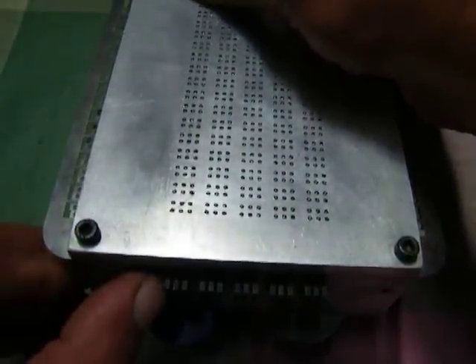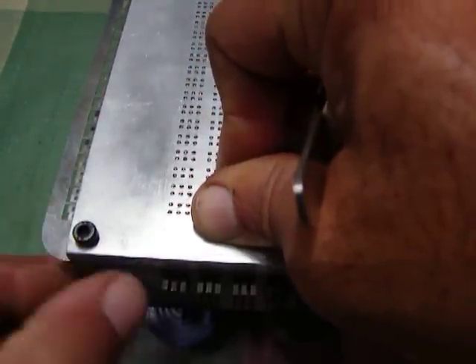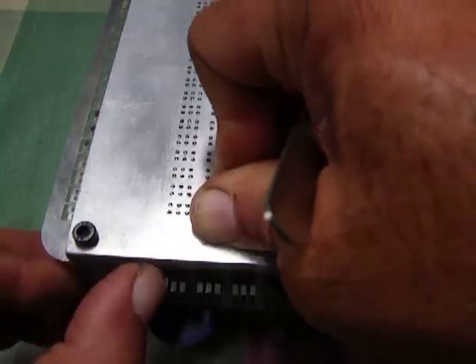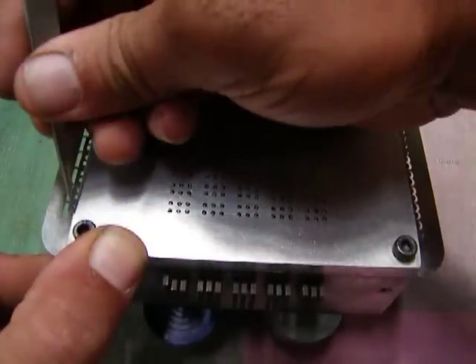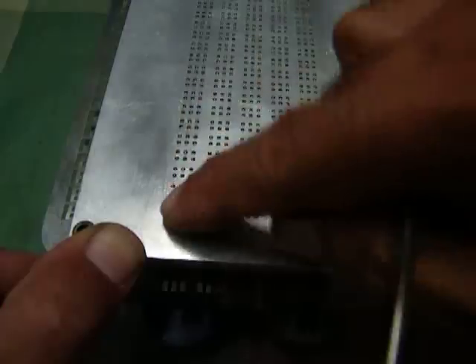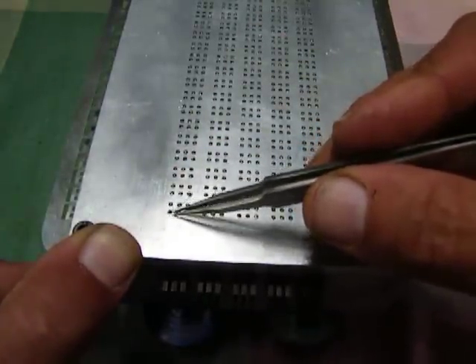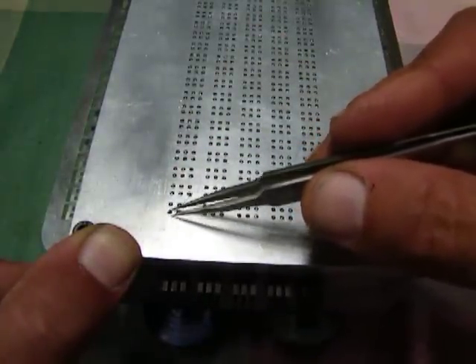I set it by row and column. So row 1, column 1 enabled, set with row, then I latch it in position, lock again, and after I release the row actuator, only column 1 dot 1, that is A in this case, is enabled. I can do the same.